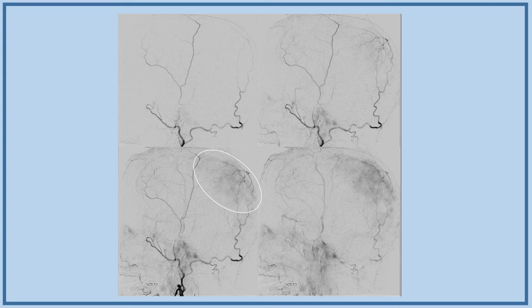So should we go for it or not? Well, we don't really know at this point, but why not try? I think probably a decent idea to go for it. I don't think the risk is particularly high, but we want to be effective. What do we do? We take this microcatheter, the Headway Duo, one of our favorites, and you go up and you get this picture.